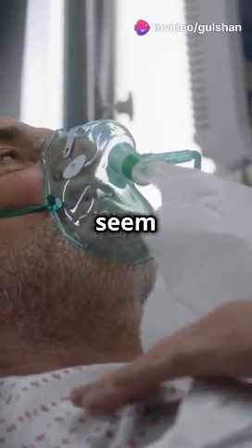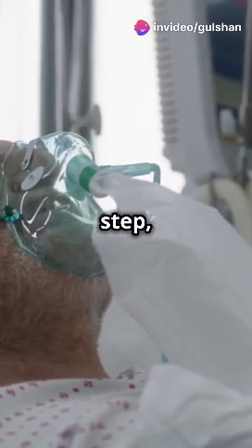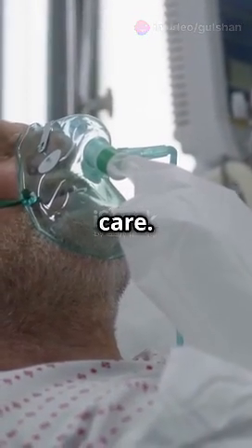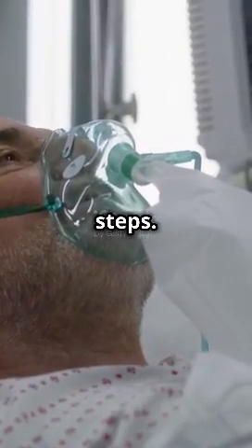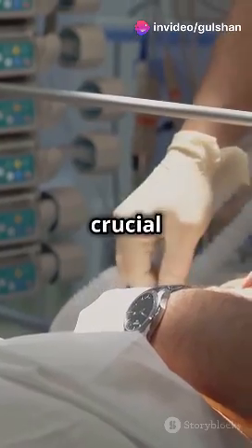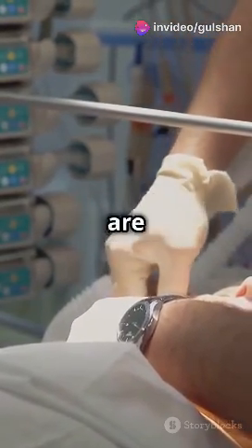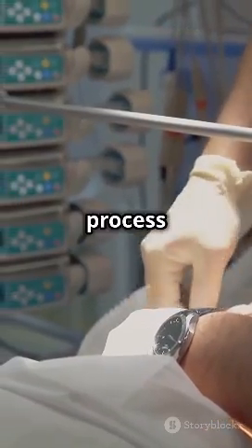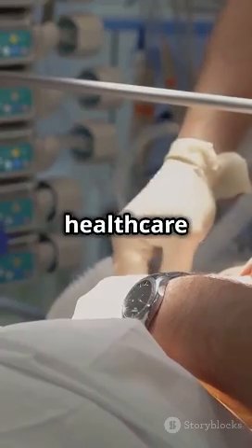The process might seem daunting at first, but with practice and a clear understanding of each step, it becomes a routine part of patient care. Let's break down the process into manageable steps. First up, sedation and paralysis. This is a crucial step because it ensures that the patient is comfortable and their muscles are relaxed, making the intubation process smoother and less stressful for both the patient and the healthcare provider.